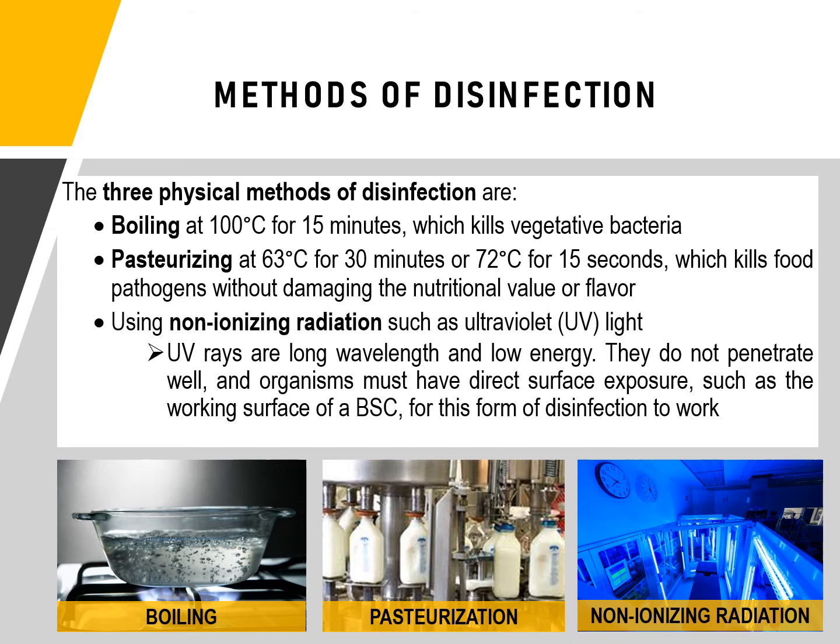You still have to let the milk undergo pasteurization to remove any pathogens. And we have our non-ionizing radiation, and as you can see in the picture, that is very common among laboratory sections such as the microbiology section.